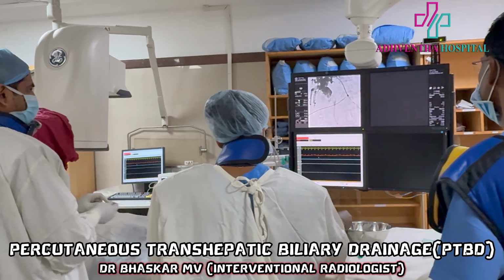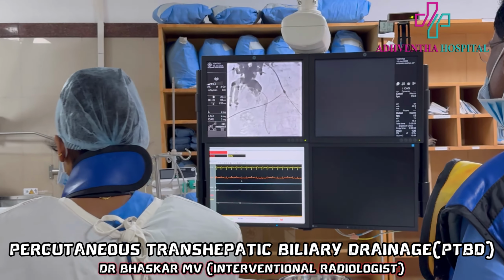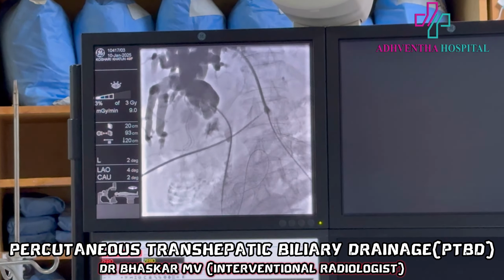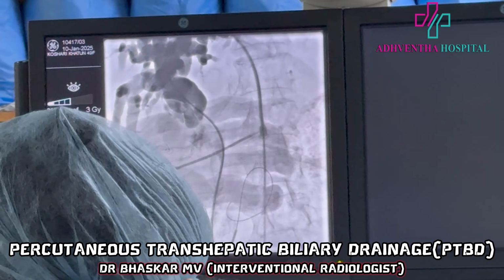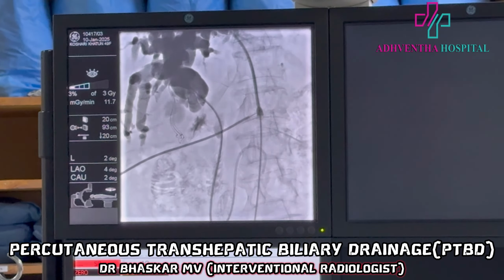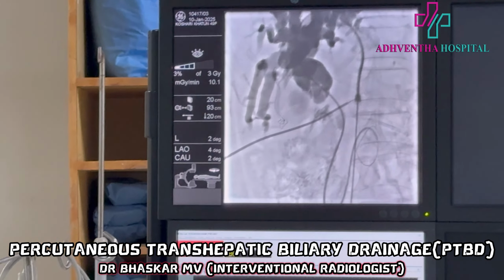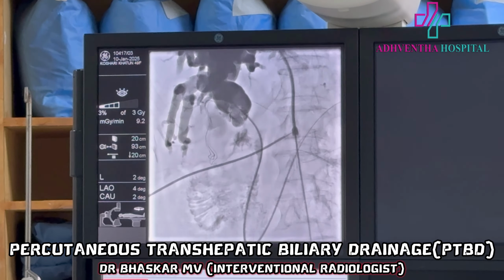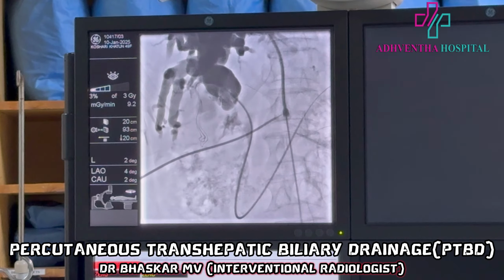The wire will be placed deep into the duodenum, maybe the fourth part, so that the wire remains stable, and then we can exchange that with a catheter. See, that is the beauty. The peristalsis will take the wire forward.